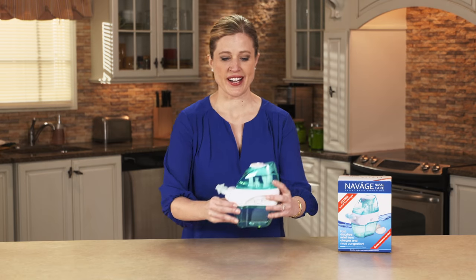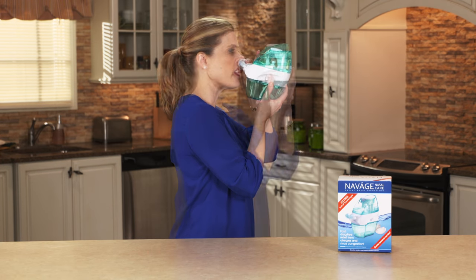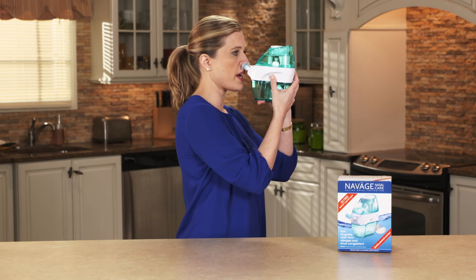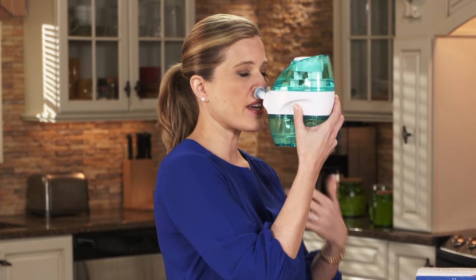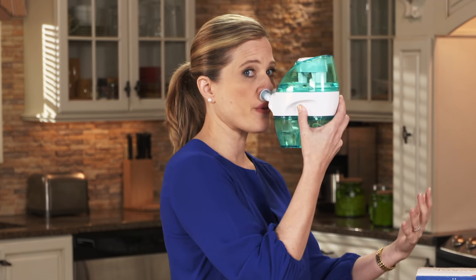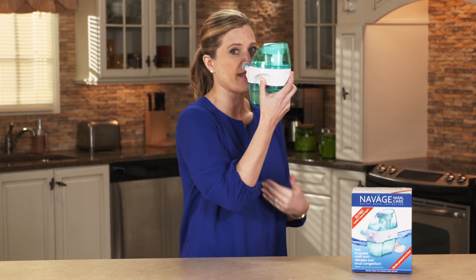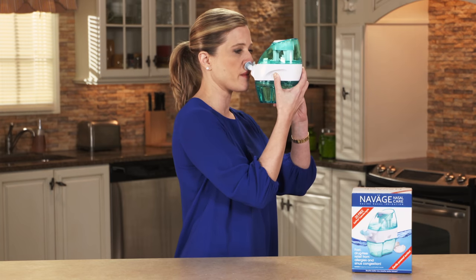Now we're ready to get started. Put the nose cleaner up to your nose, insert the nose pillows, then press the power button firmly all the way — this starts the cycle. During the cycle you just want to breathe naturally through your mouth. If this is your first time, you don't want to be talking like me; that's something you can do once you're used to it and have done it many times.